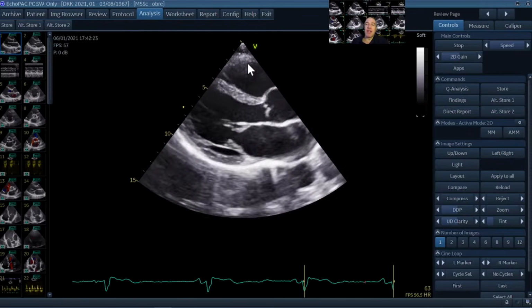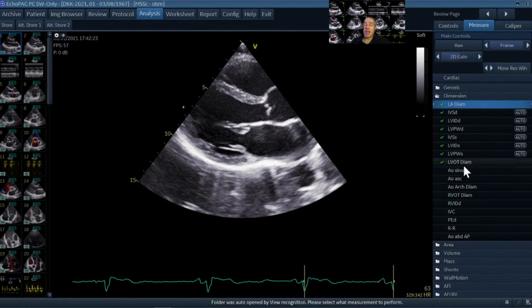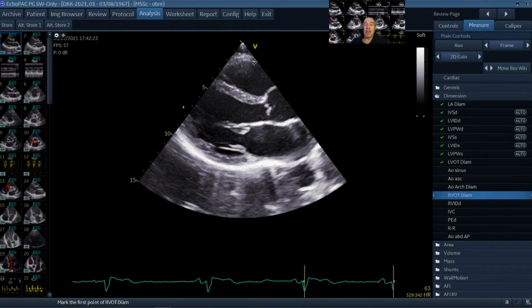What is the diameter here of, this is actually the right ventricular outflow tract, as I said, but you can measure here the RVOT diameter, and again I do this in a slightly adapted anterior posterior direction, and in this lady the diameter is below 3 centimeters, and that is a normal value. As soon as it enlarges above 3 centimeters, 30 millimeters, you should get the suspicion that there is some problem in the right ventricle.